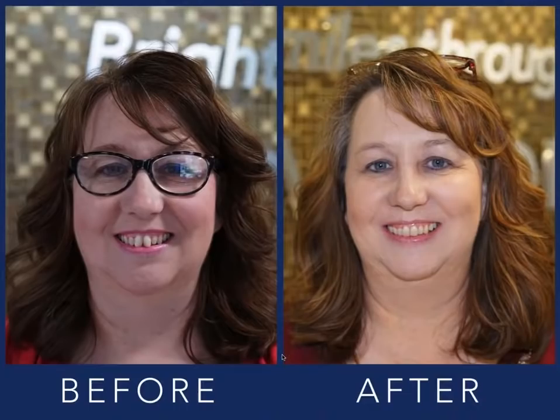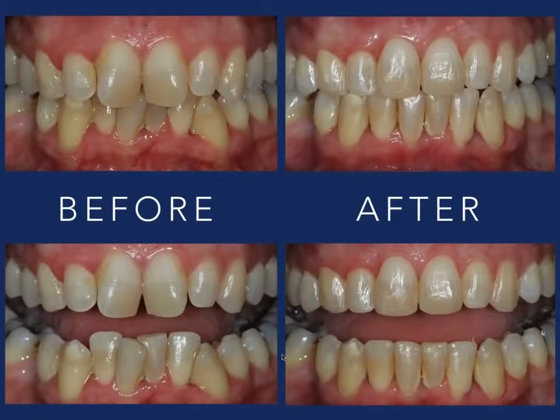All right, this lovely lady had those front 2 teeth bugging her, as you could probably bet. They were pretty severely rotated, and there's a lot else going on here, so we'll look at that. A lot of crowding, right? A tremendous amount of crowding, and some pretty severe rotations.